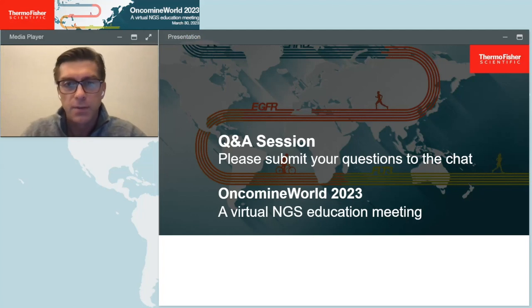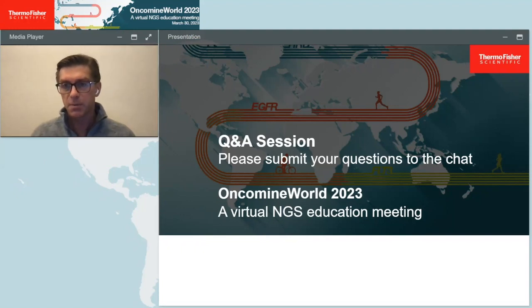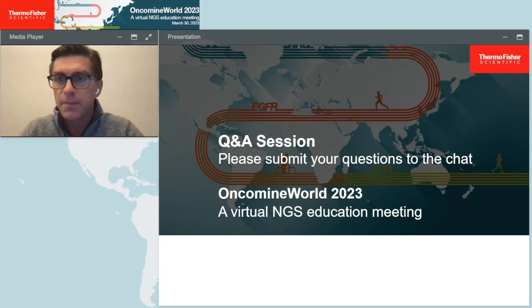And if you didn't catch it there on the last slide, we did want to call out that the virtual environment now has support for multiple languages, not just English. So if you're looking to see if your language is actually supported, please do check it out and see if the language that you prefer is on there. So let's start with a few questions. We have a few preloaded from before, so we'll start with these.